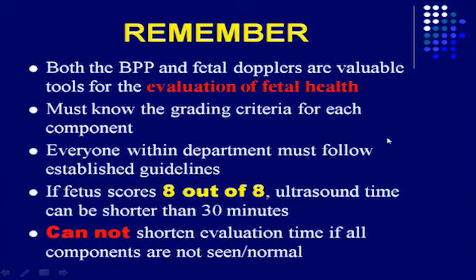And just for legality's sake, go back to your first image and see what time you started, because that's what they're going to look at. If you're a minute or two short, they're going to say you didn't do the full 30 minutes. So make sure you go back to your first. If they're not doing it, go back and look. When did you take that first image? Because it's all about documentation there.